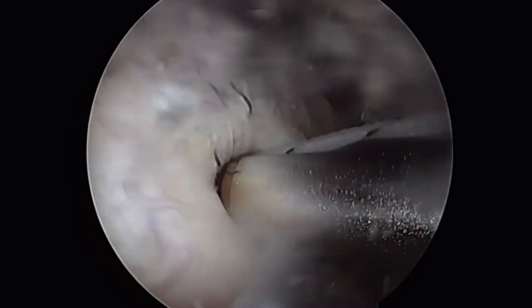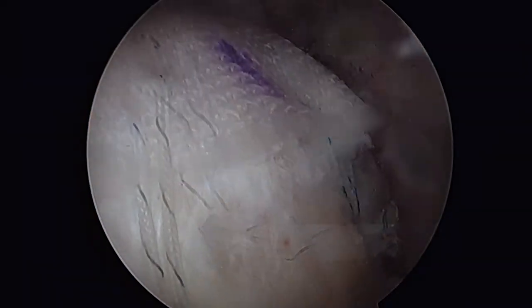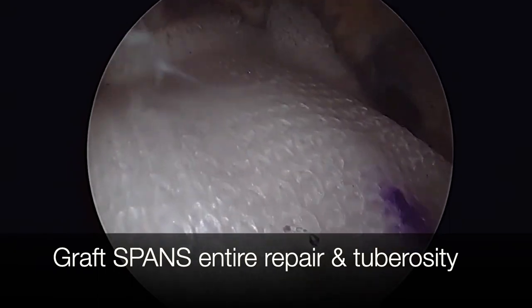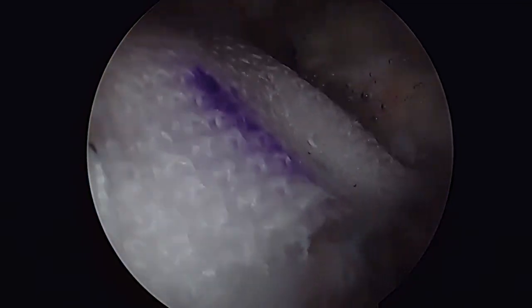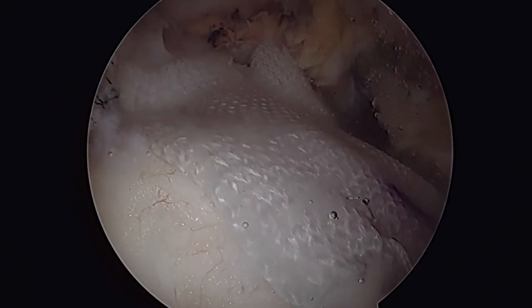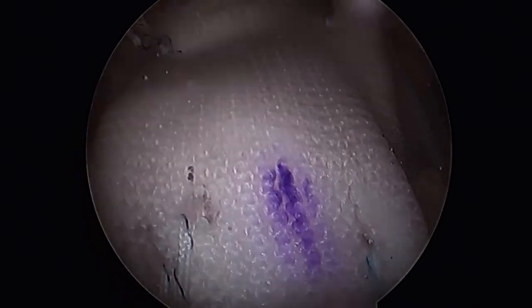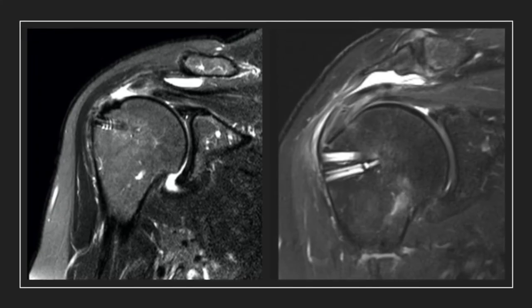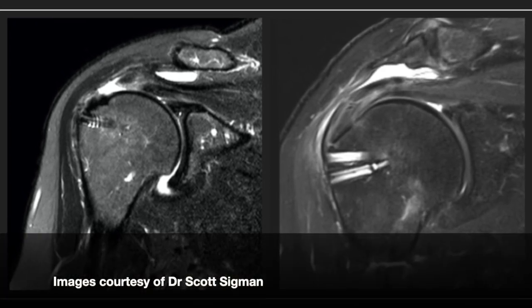The BioBrace graft is placed such that it covers the entire rotator cuff footprint. Despite doing a low-tension medially based single row repair, the spanning of the graft conducts cellular ingrowth and healing across the entire greater tuberosity. The PLLA fibers provide time-zero tissue reinforcement and structural strength before generating a thicker regenerative tissue layer and then eventually resorbing. Ideally, rotator cuff repair augmentation with bioinductive grafts that have strength will help to regenerate thick, strong tendons, as seen here after use in a revision rotator cuff repair.